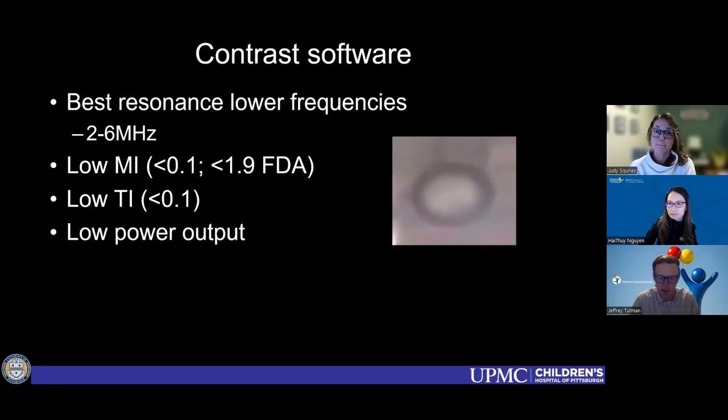Even if we're just looking at a single lesion, if we get a good look at it with the first injection, I'll almost always take advantage of having that second injection and just tweak a couple of things, either try a different probe or a different window, just to get a different look at it. But overall, I agree. I generally prefer the linear as well.